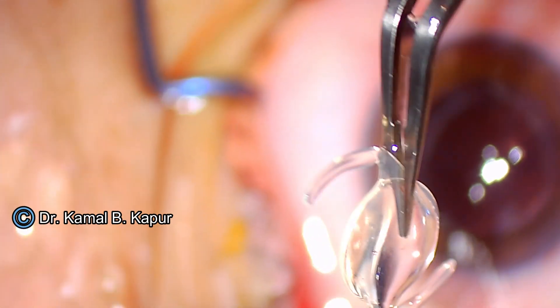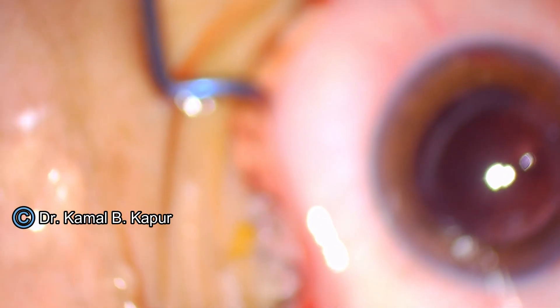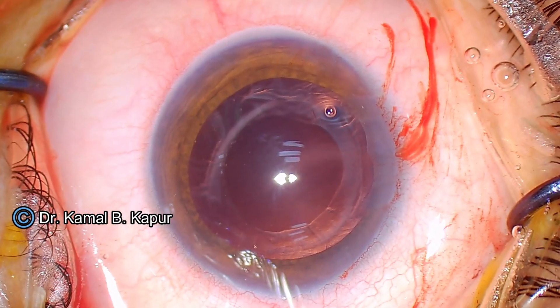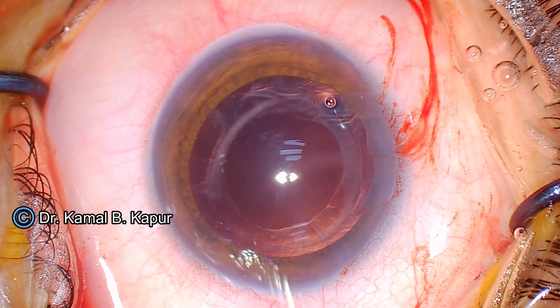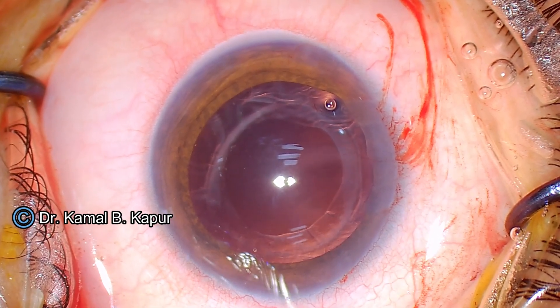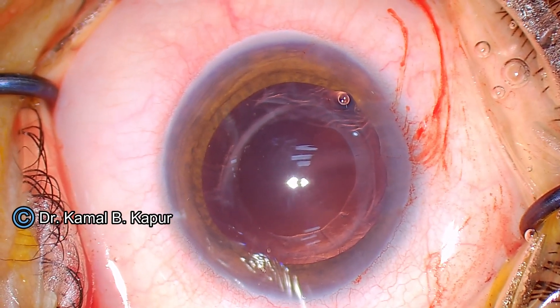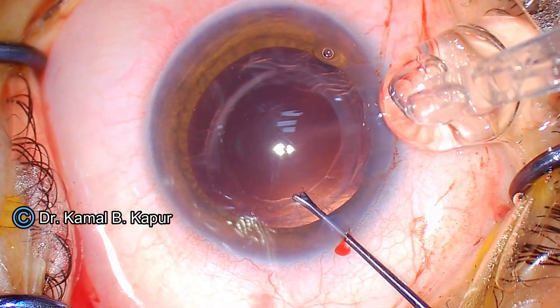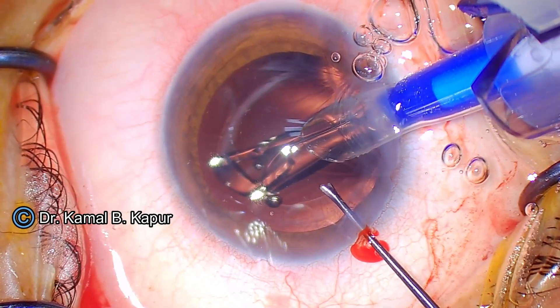This is a very simple methodology of removing this particular lens. Once the lens is taken out, all I need to do is introduce the new lens inside. I will put a single interrupted suture in the center of the incision. A 5.25 millimeter incision with a suture of adequate tightness placed in the center will give an approximate wound size of 2.9 millimeters.